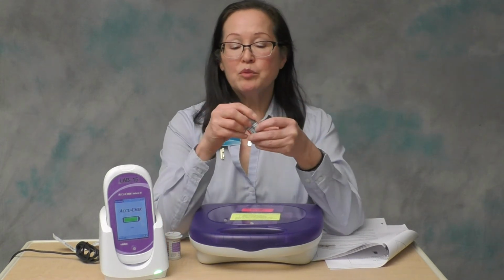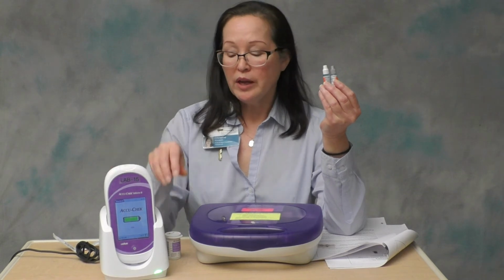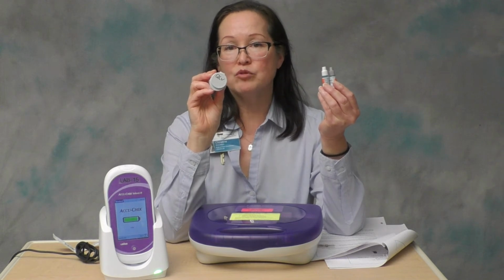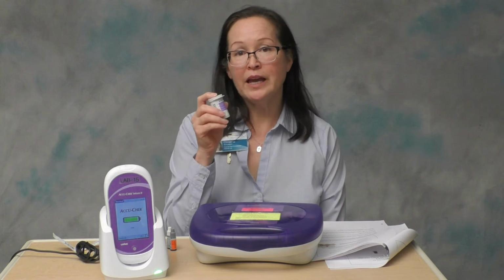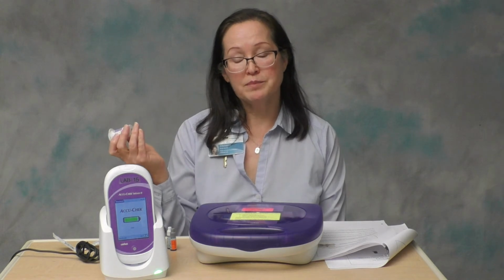So the times when you run QC: again, every 24 hours on every meter. Every time you open a new vial of test strips, and document it by writing QC check on the lid of the strip vial. If you come across a vial of test strips that have the lid off or ajar, you may run QC on those strips, and if they pass, snap the lid down and you can continue to use them. If it fails QC, you have to toss the entire vial of test strips.